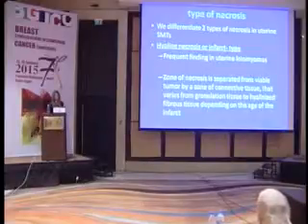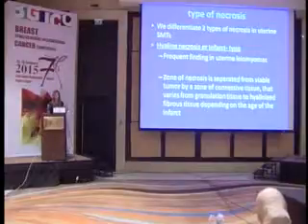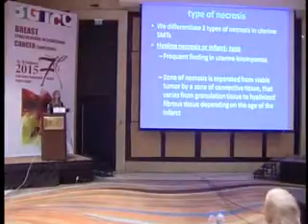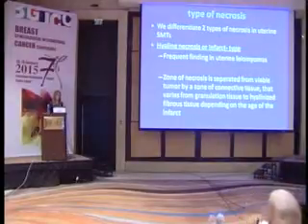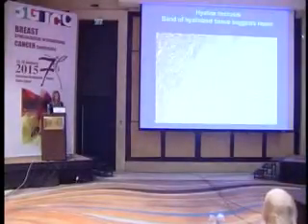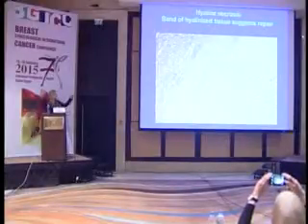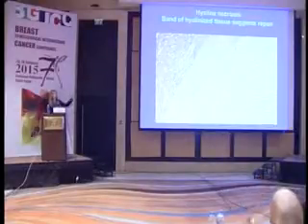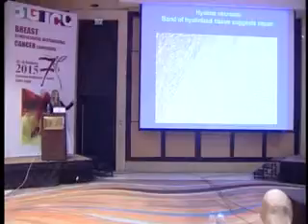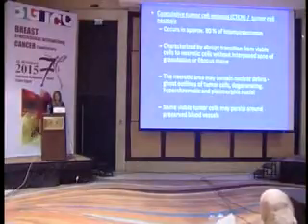The difference between hyalinization, infarct type necrosis, versus tumor necrosis is very important to differentiate, and sometimes it can be very tricky. And this is again where I show my cases. And this is hyalinization. It's granulation tissue. This is what I want to say. That transition to the normal, we call it granulation tissue transition. You see a few blood vessels, you see a few lymphocytes, neutrophils sometimes, so it looks different.